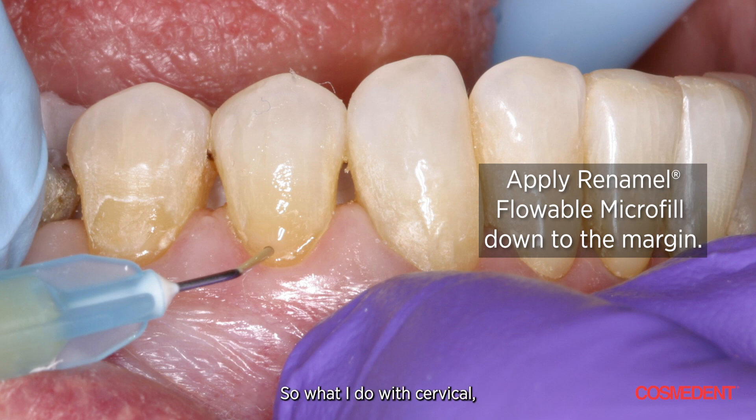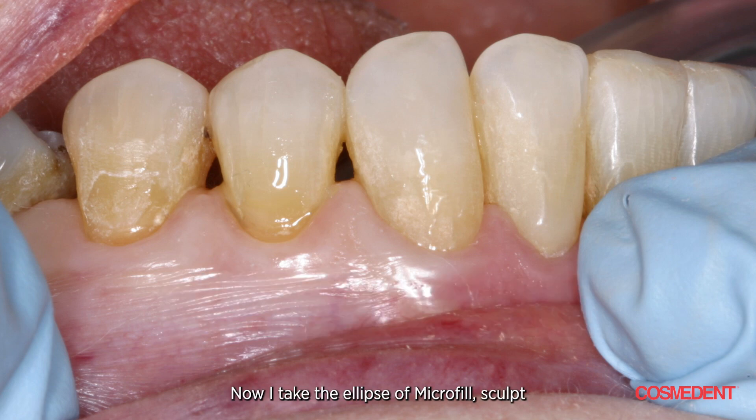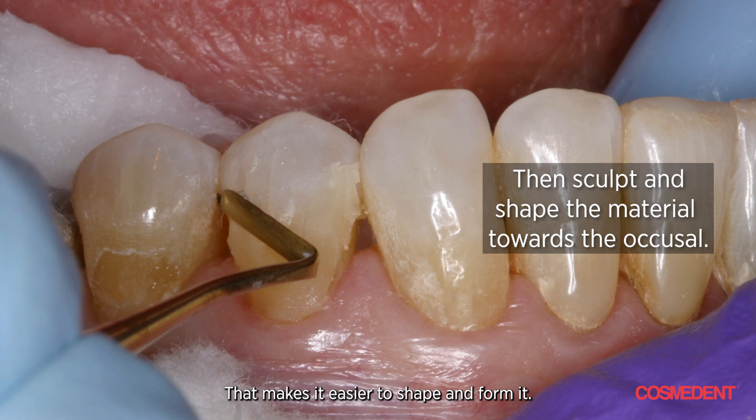So what I do with cervical restorations is put a small amount of flowable microfill in there — these are all nanofill replacements now. I put a flowable microfill in there, slightly underfilled, keeping the concavity. It goes down and slightly seals the margin. I polymerize that. Now I take an ellipse of microfill, sculpt and shape it — it's going to stick to that area much better. I tack it down towards the gingival and sculpt towards the occlusal.